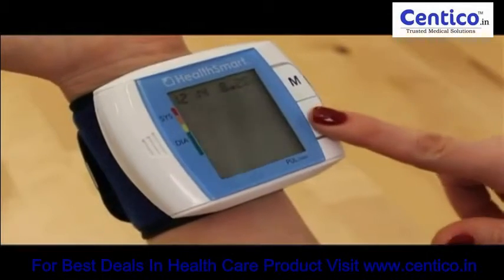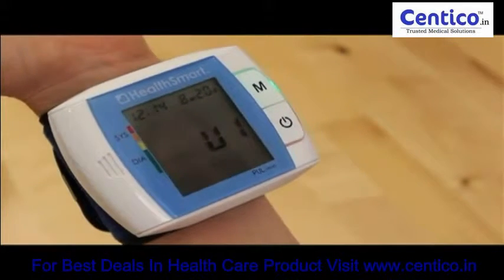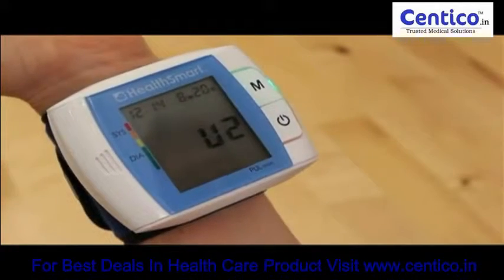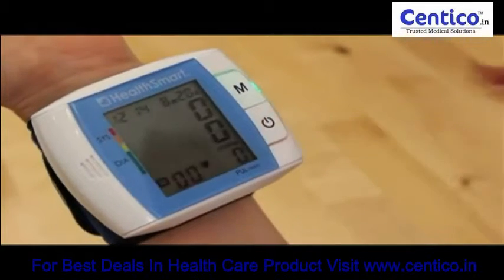Press the power button. Select the memory bank you want your reading to be stored in by pressing the memory button. Press the power button to confirm your selection.